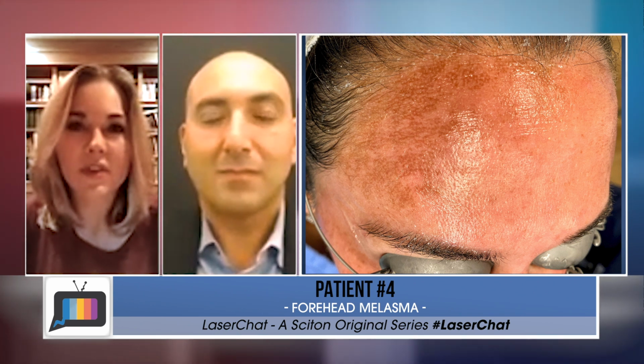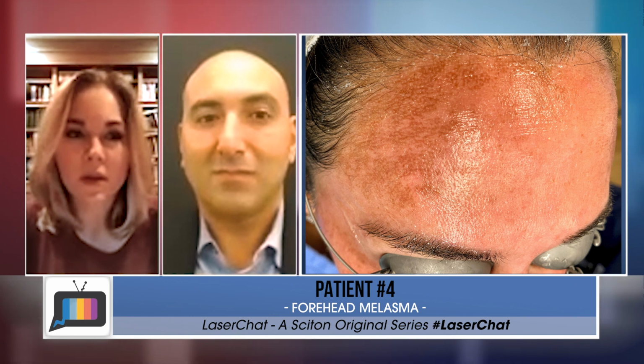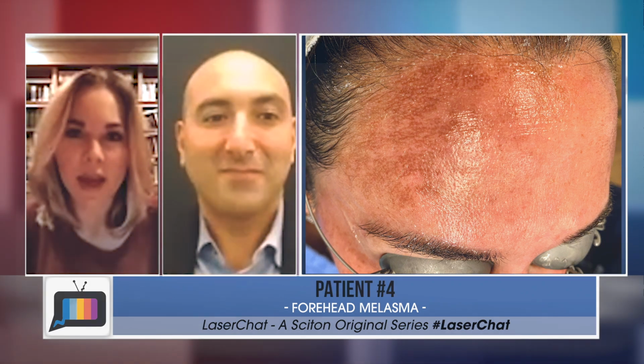So maybe doing 10 millijoules and 10% coverage, and doing a series of treatments about 4 to 6 weeks apart, and potentially adding some at-home Triluma, the hydroquinone, if the patient could tolerate it, and try to sneak up on the melasma that way.